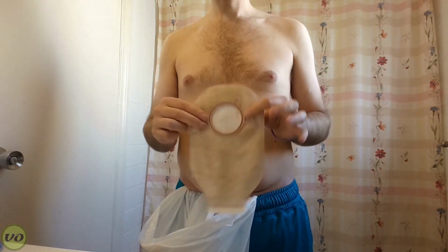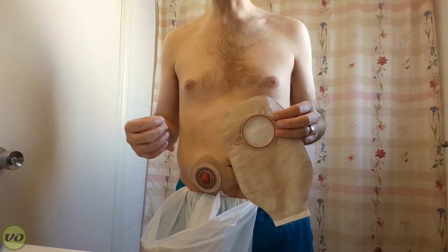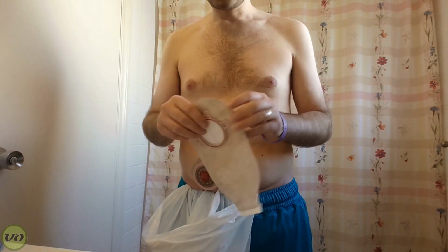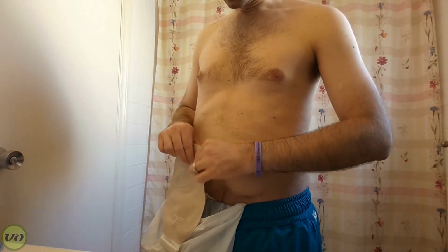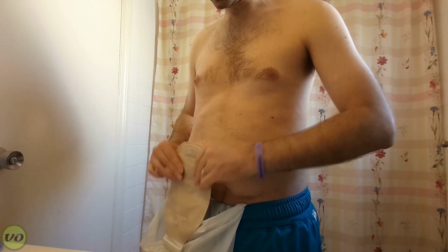Now, Hollister uses a two-piece mechanical system. This does not have a lock on it or anything fancy. It just basically clicks in place. With some appliances like Coloplast Sensor Clicks, they will have a locking mechanism on there. So this one here I'm just going to put on, and you'll hear the click as I get it on, and the click knows that everything is going to be secure. Okay, so you heard that click.